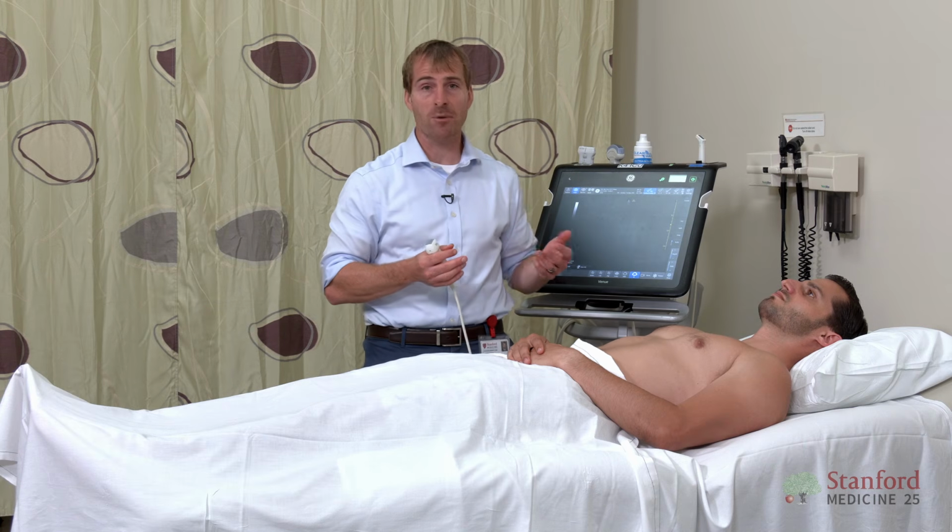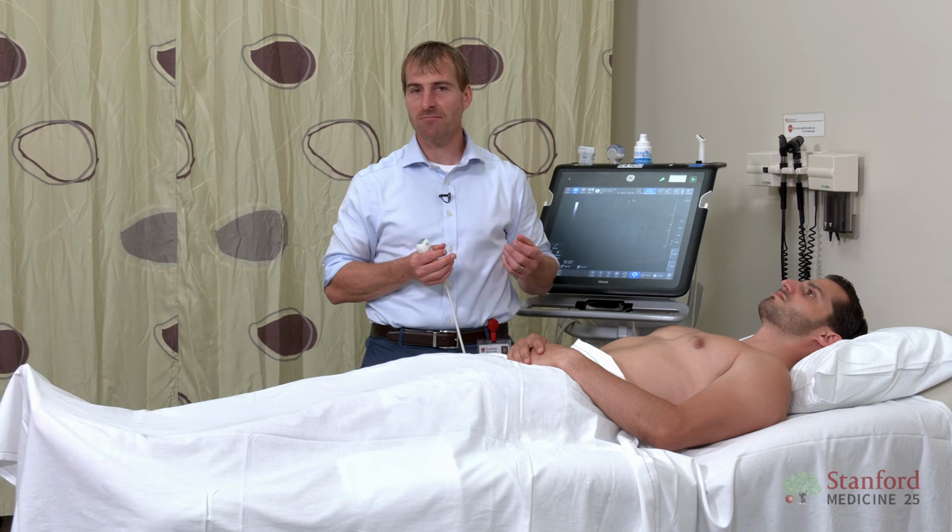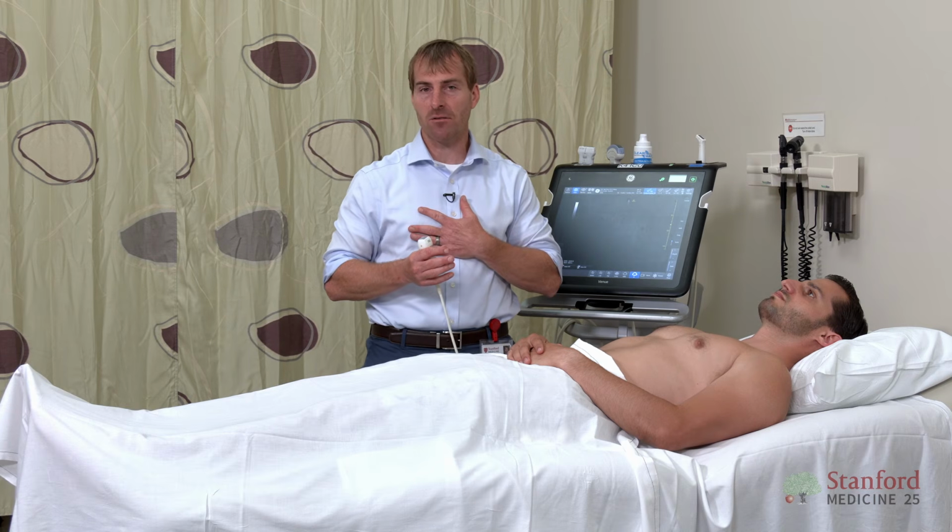Now let's imagine that our patient is an elderly person who's confused and quite ill. And I say, hey, sniff for me. And they're having trouble understanding. That's going to be a much more difficult IVC to interpret. Their slight inhale isn't really going to collapse their IVC much because they're not generating a lot of negative intrathoracic pressure. Similarly, now let's imagine you've got a patient with pulmonary fibrosis or an asthma attack, where every time they need to take a deep breath, they need to generate a lot of negative intrathoracic pressure. That person is going to be much more likely to start collapsing their IVC when they take a deep breath, because every time they take a deep breath, they generate all that negative intrathoracic pressure.